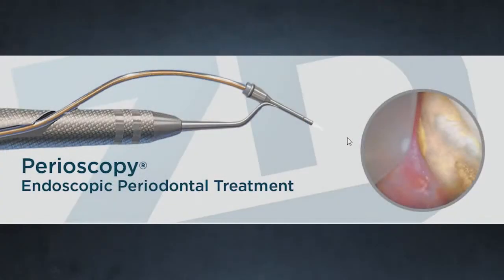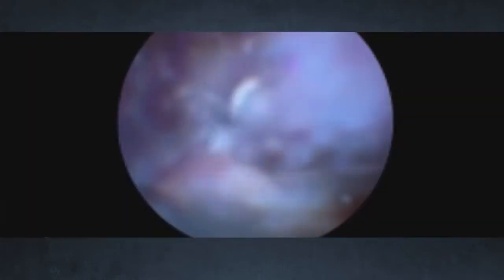For that part of the treatment, we rely on highly skilled, highly trained hygienists who are experts in a unique treatment called perioscopy. Perioscopy uses a perioscope. The perioscope is a marvelous invention, and it's the key to the non-surgical treatment of your periodontal disease. It's a tiny camera that's placed below your gum line and magnifies your root surface by a power of 40. That means that your hygienist can explore every portion of your tooth below the gum line and identify the hard bacteria called calculus that is attached to your root surface. This calculus is removed with delicate instruments called curettes to make your root surface bacteria-free. The tissue and bone are more likely to heal against a clean, smooth root surface.